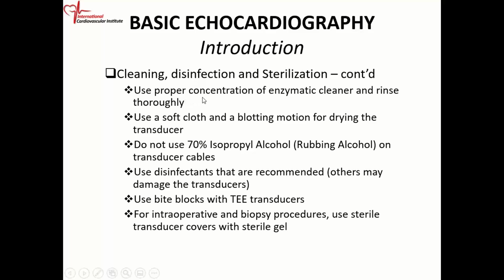There are specific cleaning agents that are recommended. Use a soft cloth, and use a blotting motion for drying. Do not use rubbing alcohol on the transducer cables, because that's a fire hazard. Rubbing alcohol is 70% isopropyl alcohol. And again, use disinfectants that are recommended.